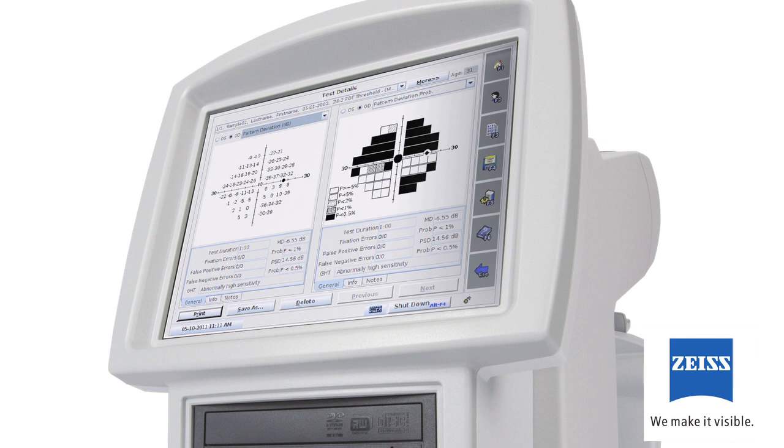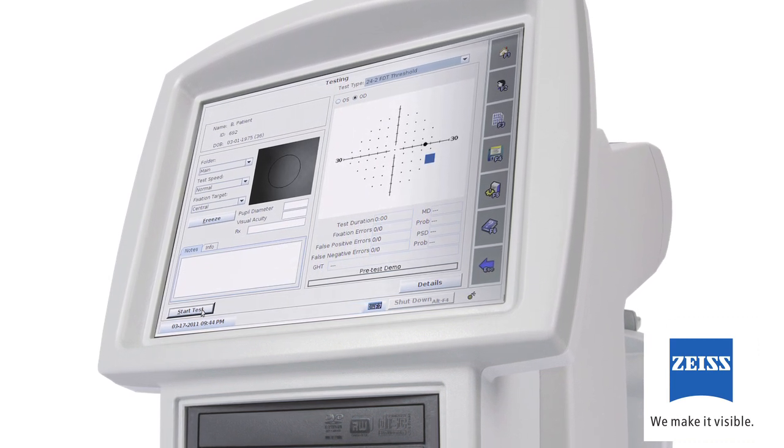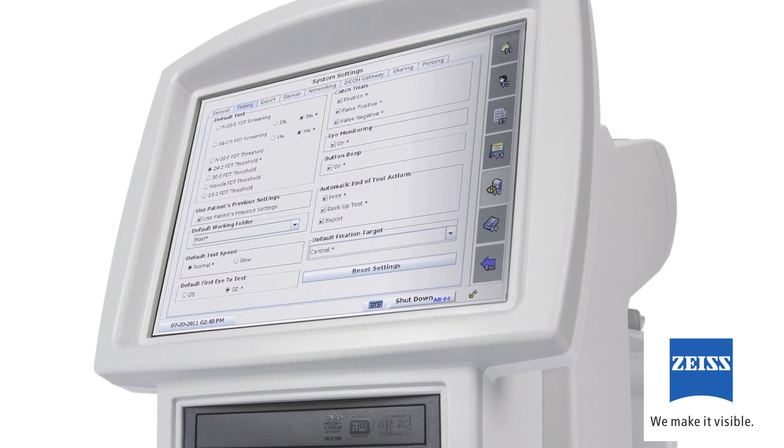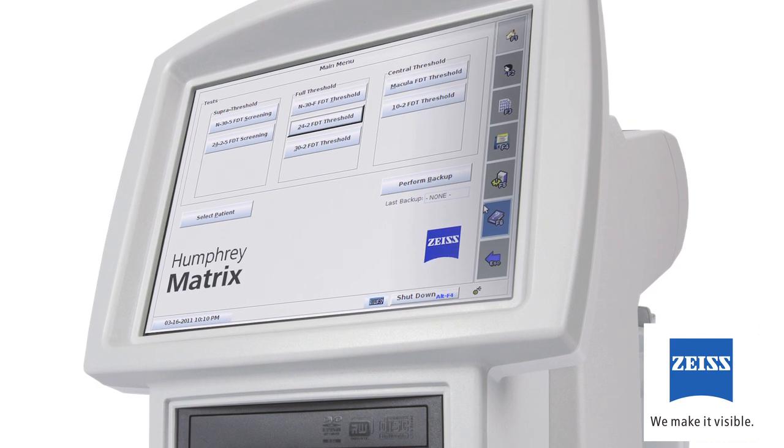You'll find your new Humphrey Matrix 800 even easier to use if you take a few minutes to watch this video before you start using the instrument in your practice. If you need more information after watching this video, please refer to the user manual.